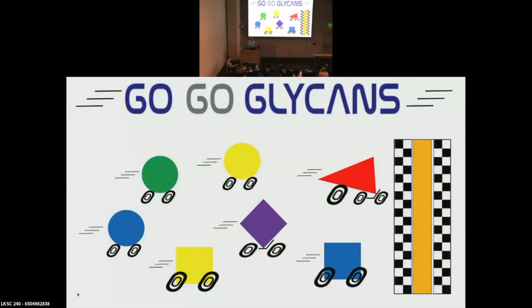And historically, we don't know most of the proteins that are carrying those. So going from everything to a couple hundred was the next step. But then you start narrowing down, well, where's a good antibody? And will it work beautifully with the MIBI, or will it work with MALDI IHC? And then you can start really getting down into it.